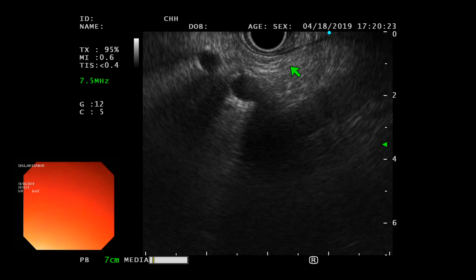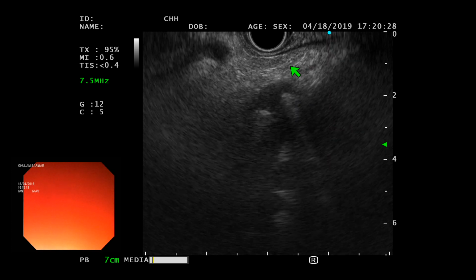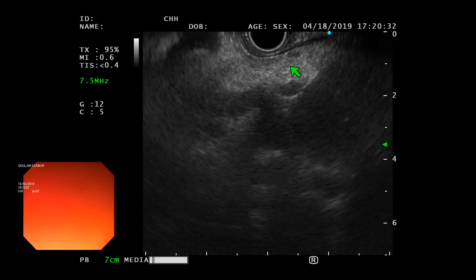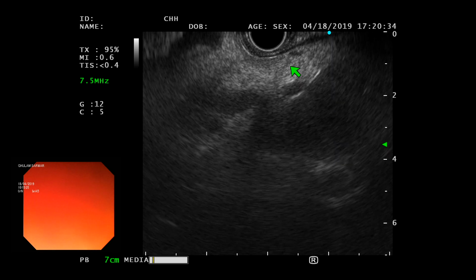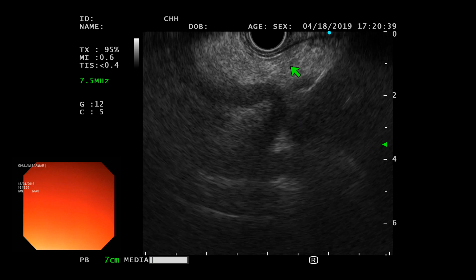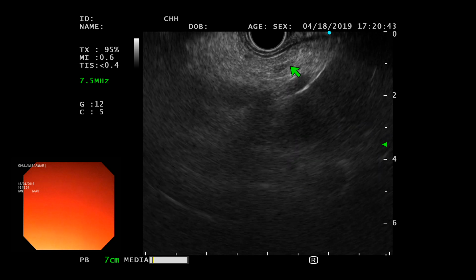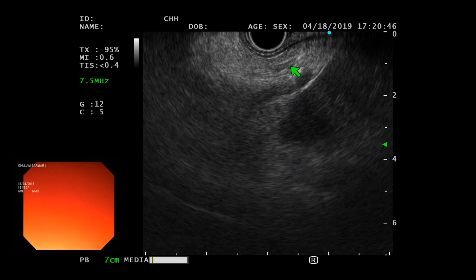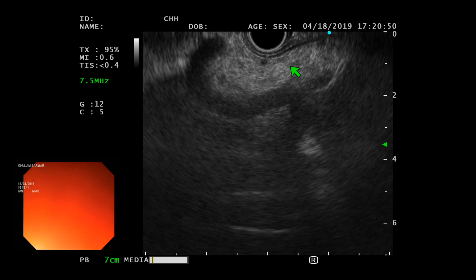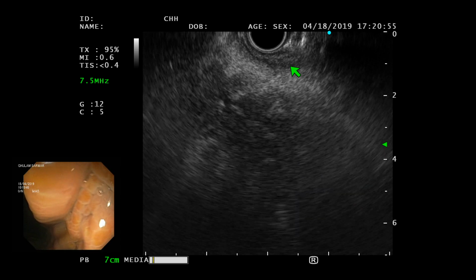Okay, good. So now we're going to follow the celiac. When you follow the celiac, you see the left gastric coming up, going to the right. Common hepatic is going downwards, and the splenic is going to the left. So we're going to just follow the splenic. We're going to forget about everything else. The splenic is going up, right? Yes. So if it's going up, to bring it down, what do you need to do? Little push. No, big wheel away from you. Just a little bit big wheel away from you, further a little bit and gently advance. And there you are, right onto the pancreas.